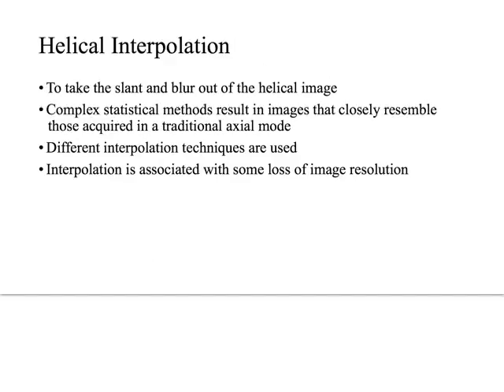So the way that we do that is through this magic trick called interpolation. Let me find where that's at. Yeah, page 52. She talks very briefly about 360-degree and 180-degree interpolation. Now, there are advantages and disadvantages to both.